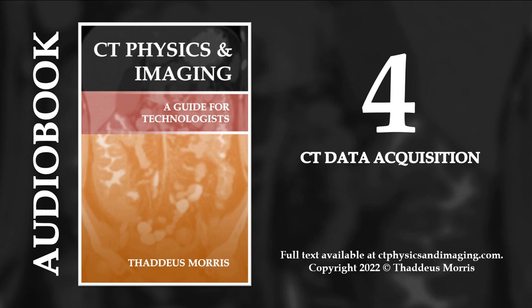The exact center of the CT scanner is sometimes called the isocenter, which is the midpoint of the x and y axes. Ideally, the anatomy of interest should be positioned in the isocenter. This ensures the radiation exposure is equal in all directions. Most scanners use laser lights that converge at the isocenter.